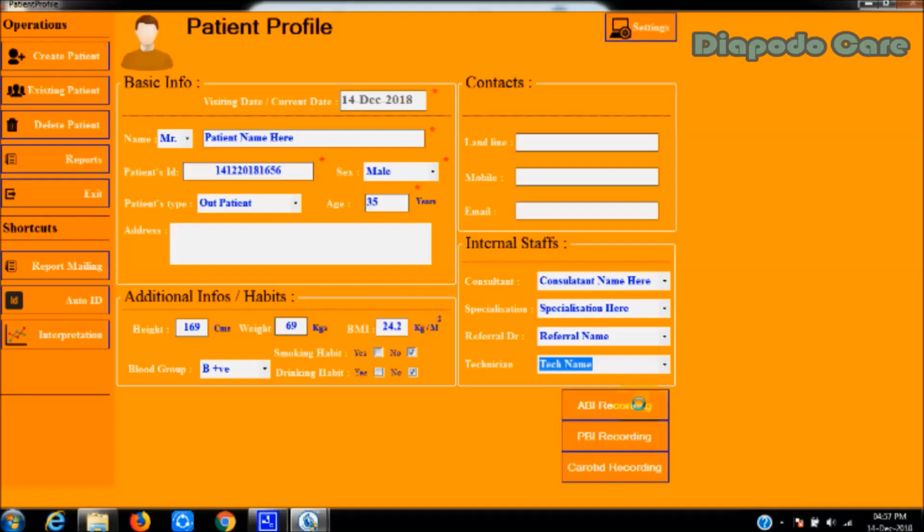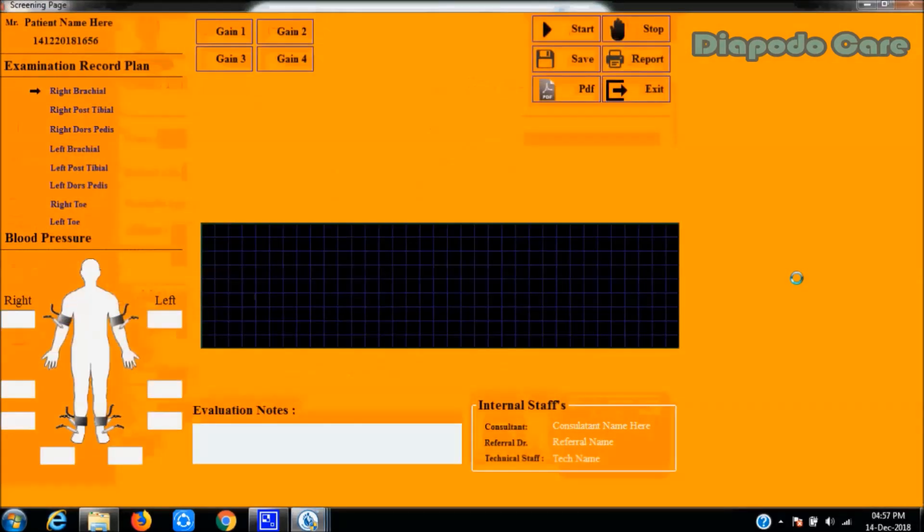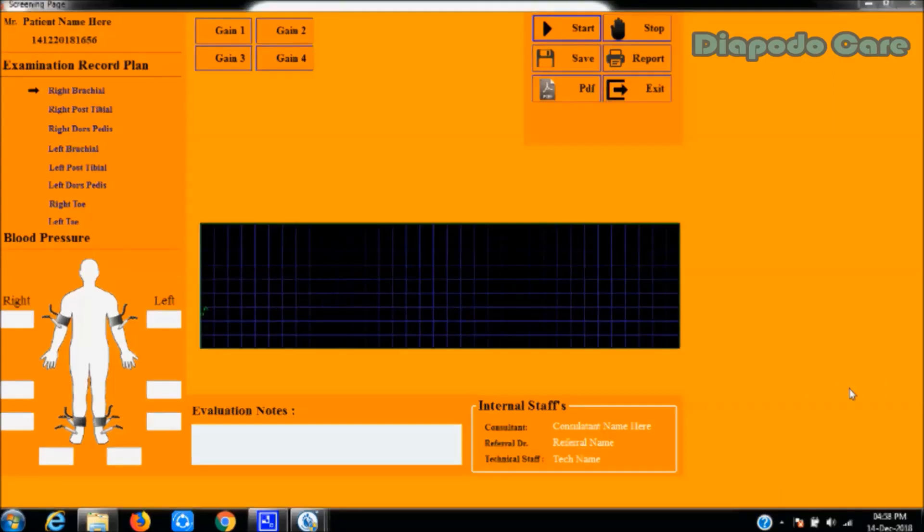Select the ankle brachial index screening option. The ABI screening window will open. After clicking the start button, the waveform of the traced artery will be plotted in the screening box. The user then needs to trace the artery to capture the correct waveform. The tracing procedure is shown in the next frames of the video.